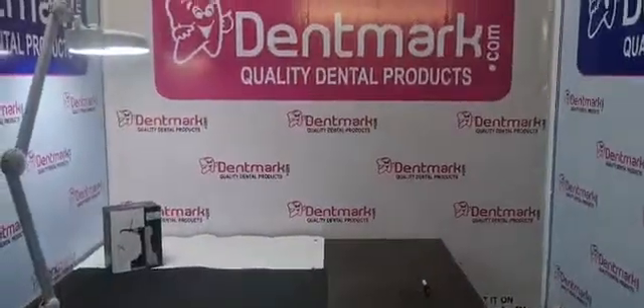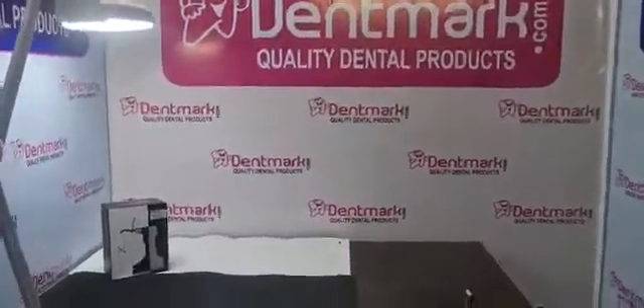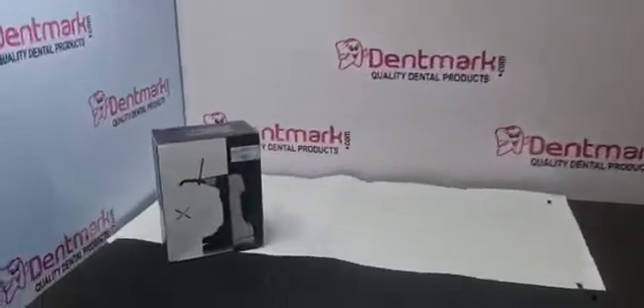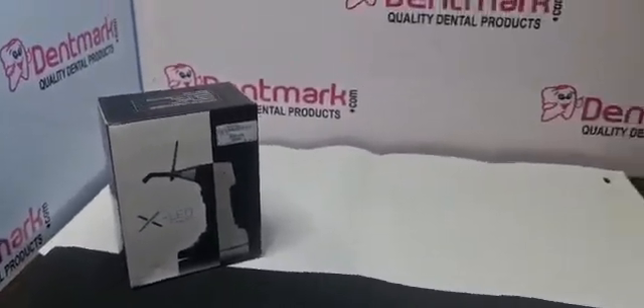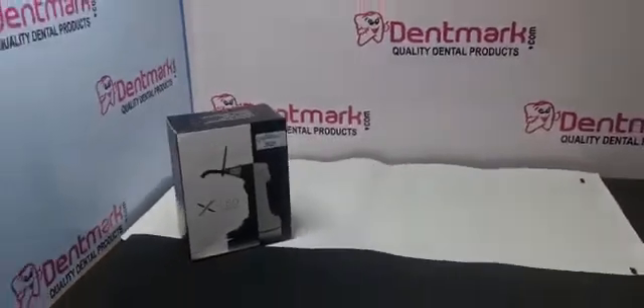Hello fans, Dentmark is going to show you another model of light cure. This is our XLED for curing and for bleaching purpose. The model is LC07.